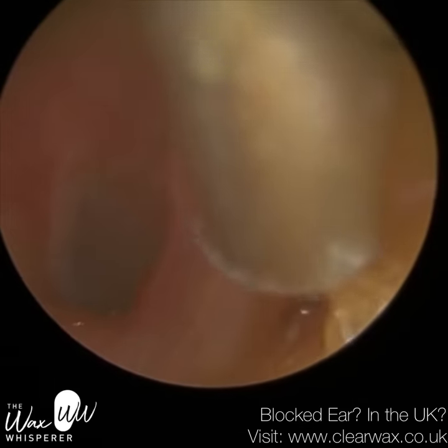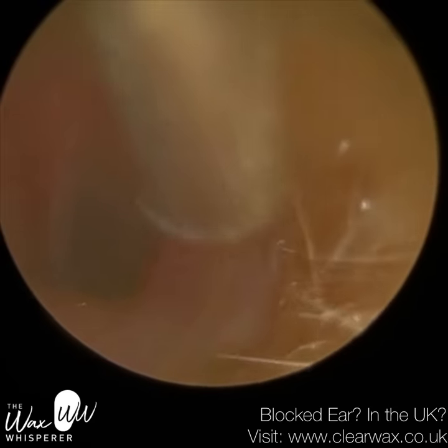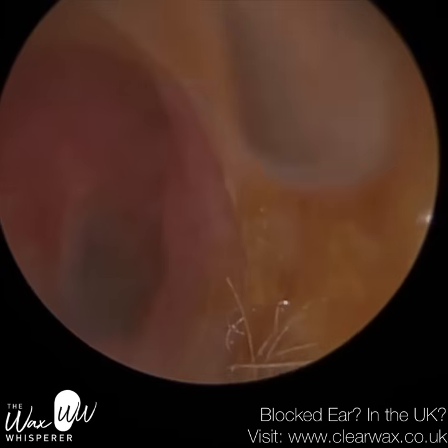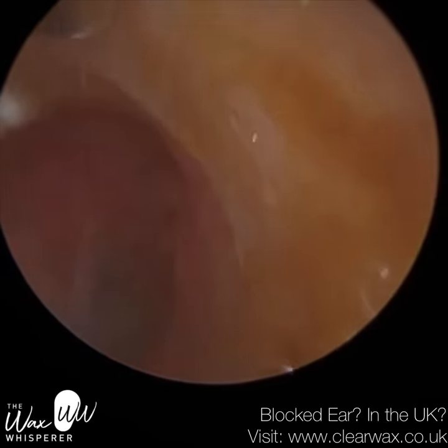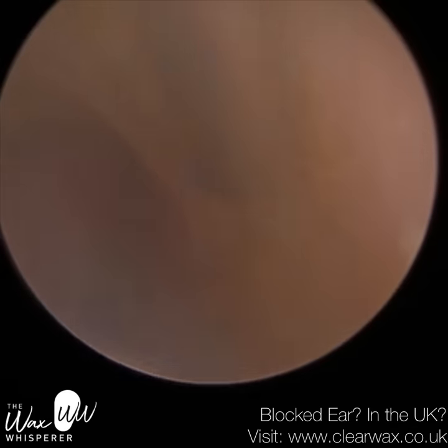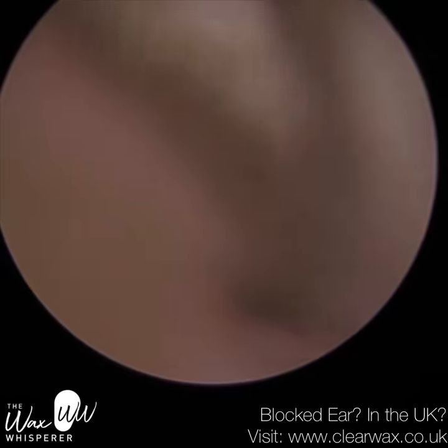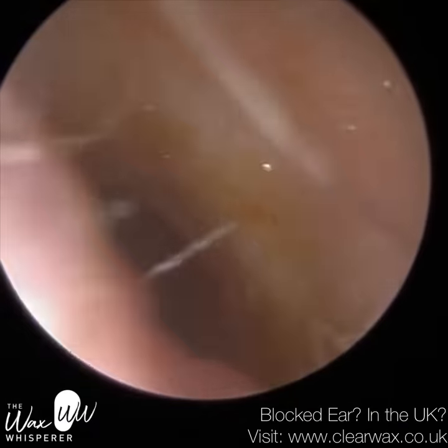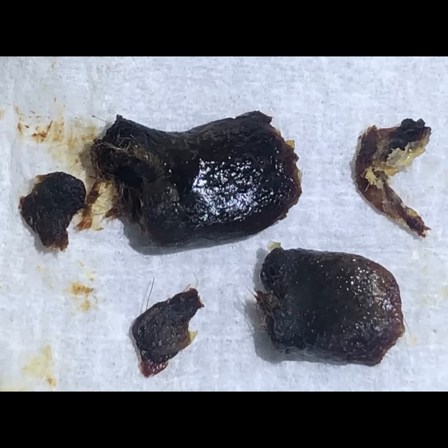But yeah, an endoscope, just the view it provides, it's unparalleled. So I'm just mopping up near the entrance. On this side, the anterior canal wall is even more prominent, and the wax plug was lodged behind that. So you can see this side is a bit more tricky. But we got there in the end. Just going to now stretch the ear open, trying to view the whole ear. So part of that eardrum is not visible to the naked eye, the anterior portion, because of that bony part that's protruding outwards. So that's that wax plug.